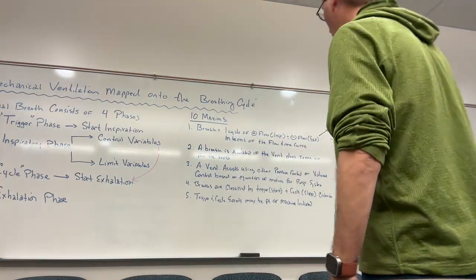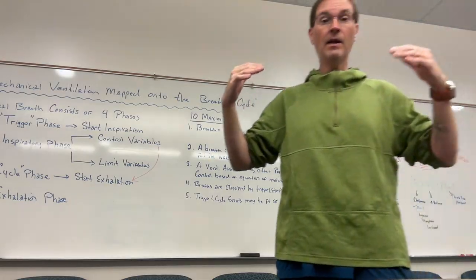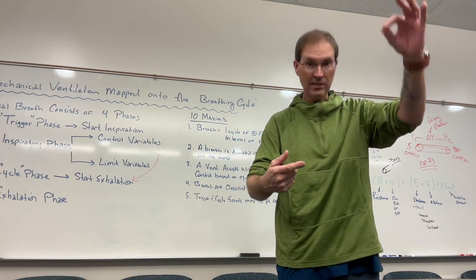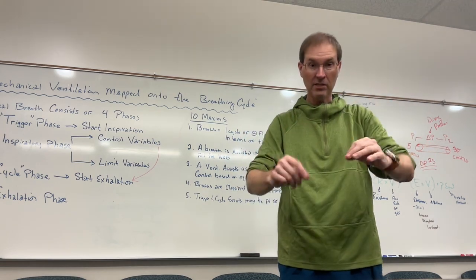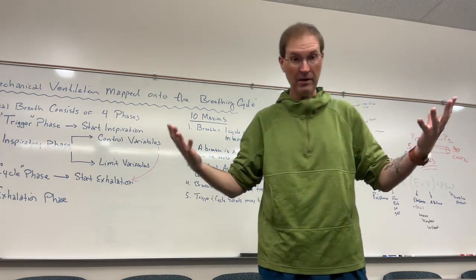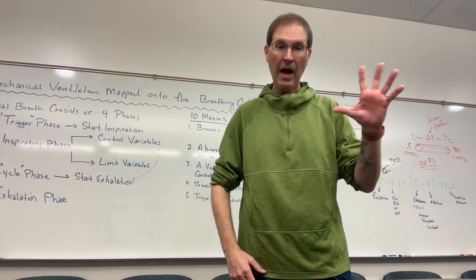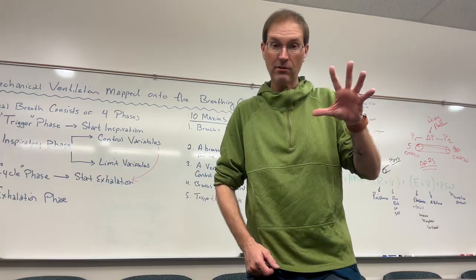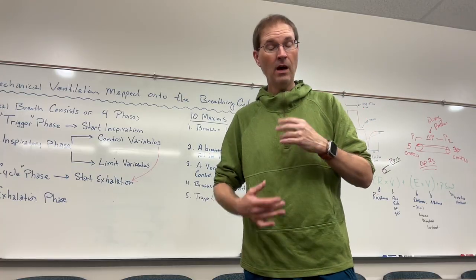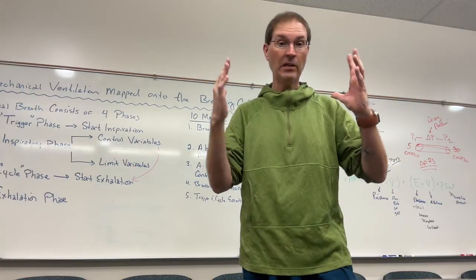All right? So hopefully things are starting to make a little more sense when we start thinking about how I actually define what the ventilator's doing. When I select some mode and I put in some settings, how do they actually map onto the basic fundamentals of respiratory physiology? All right, those are the first 5 of the 10 maxims. I'm going to talk about the last 5, which are actually, from a practical standpoint, maybe a little more important when it comes to actually understanding ventilator modes and settings.